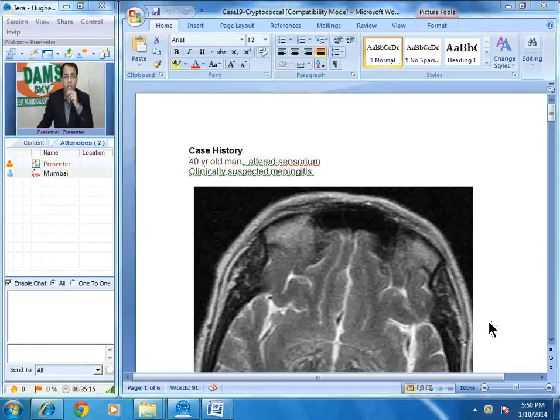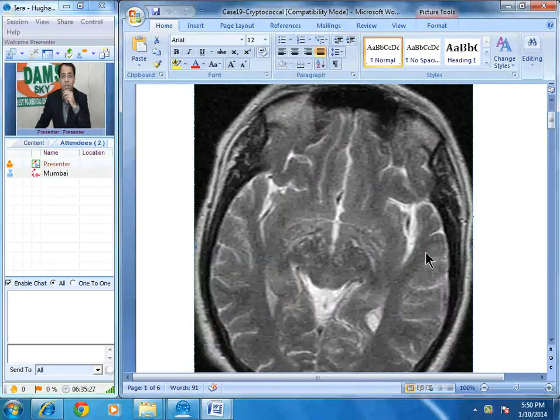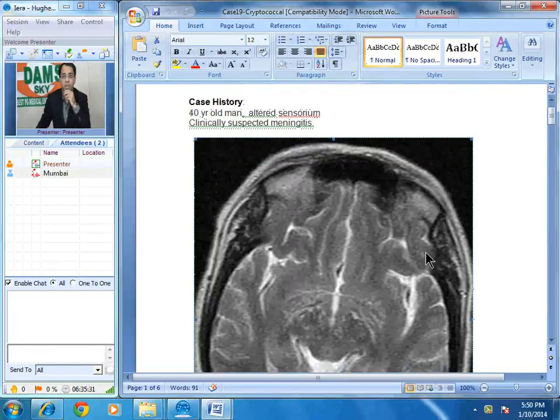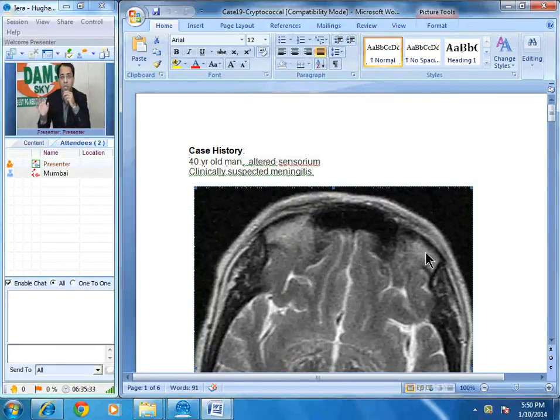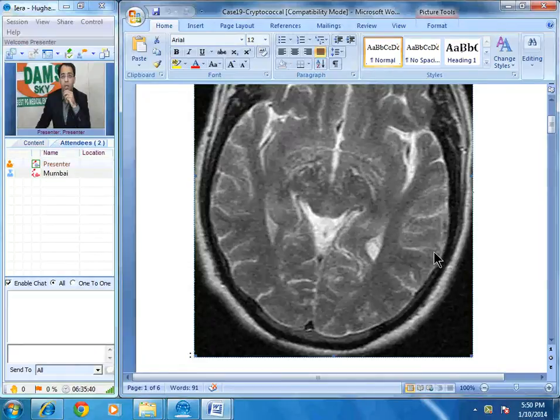Hello everybody. Today the case we are going to discuss is a unique case — a very uncommon but very characteristic finding. These are MRI images of the brain. The first image we are going to look at is an axial T2-weighted MRI brain image. Clinically, this patient presented with altered sensorium, with a suspicion of meningitis written on the requisition form.